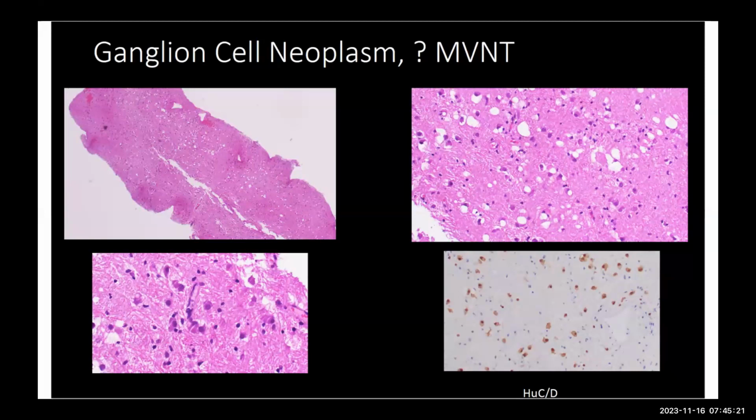So what you see on the right top is distinct vacuolation of the neuropil, first of all, which is odd. And there's also these cells which look like neurons. They have ample cytoplasm, big nucleus, prominent nucleolus, and on the left lower corner, you can see the morphology much better. They are dysplastic. They don't look normal. They are haphazard.